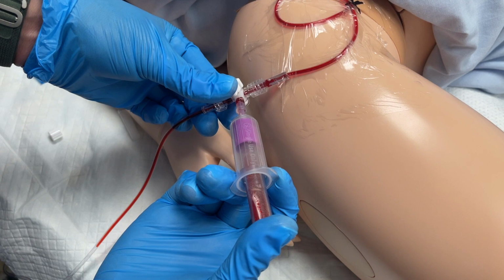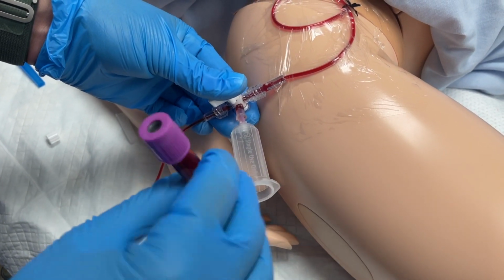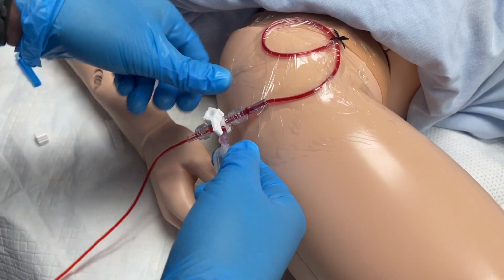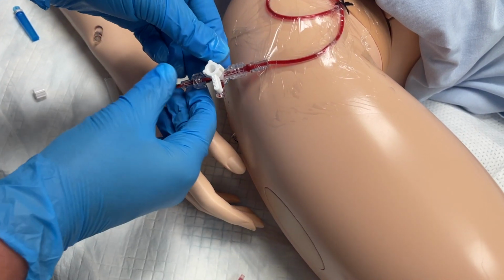These tubes are already designed to self-fill based on a negative vacuum. When we are obtaining from an arterial line, often these tubes will fill much faster than from a vein. Note that our arterial lines are simulated, so the blood fill is slower. Using your facility guidelines, invert your tubes appropriately, label at the bedside, and prepare to send them to the lab. Before disconnecting the tube transfer device, make sure and turn your stopcock back off to the air.